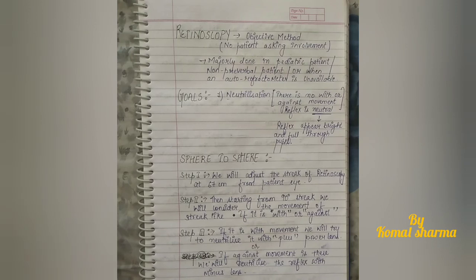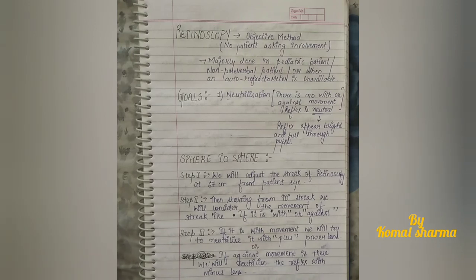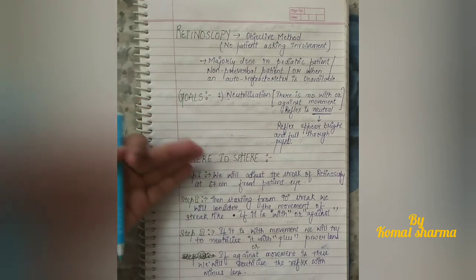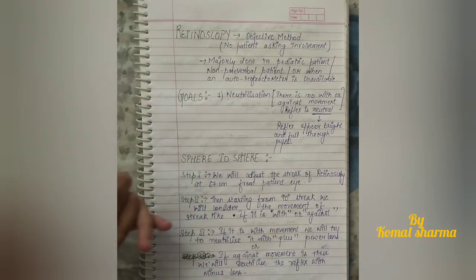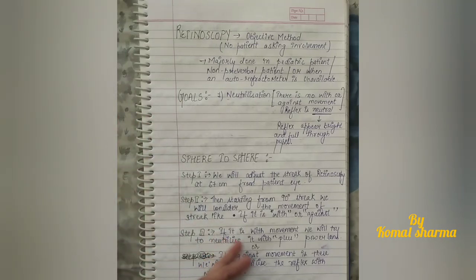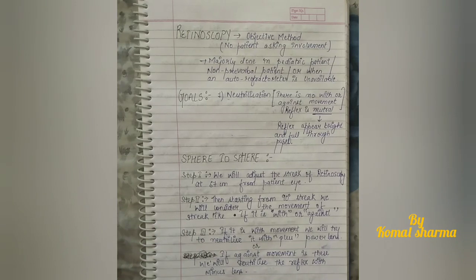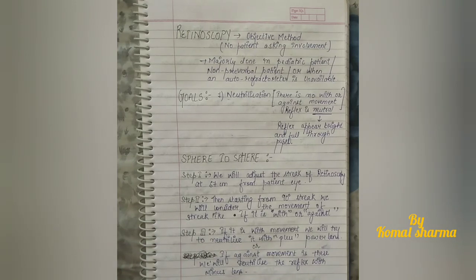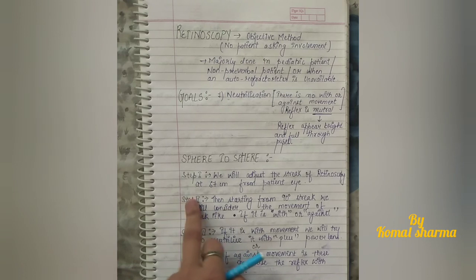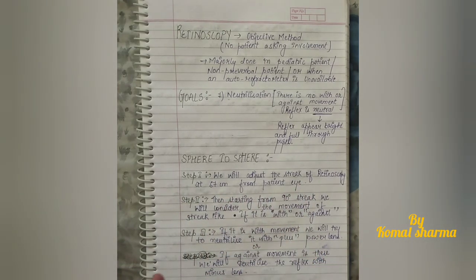As I mentioned earlier, the objectives of retinoscopy and the sphere-to-sphere method for the first and second steps are the same for sphere-to-cylinder as well. The third step is also largely the same — the first part of step three is the same, but the second part is a little bit different from the sphere-to-sphere retinoscopy method.